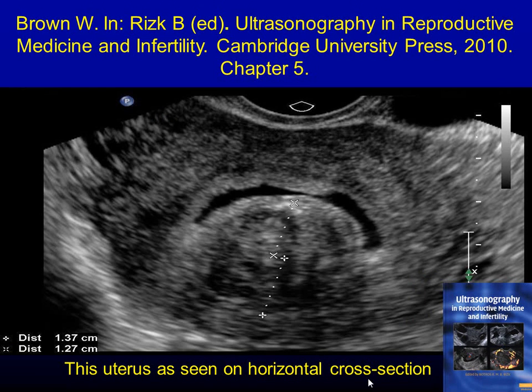Again, this is a horizontal. So horizontal means what? Cutting like that. So if the uterus is sitting like a pear here, and you chop it, so this is the uterus, this is the saline, and the fibroid is taking most of the wall. And here again to show you that the fibroid is extending into the wall.